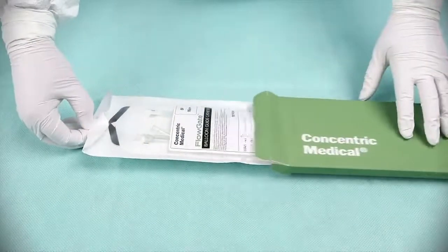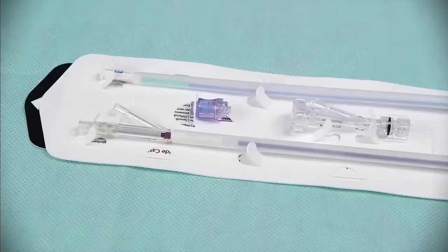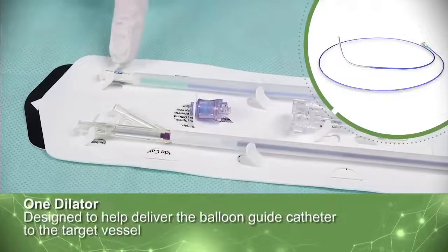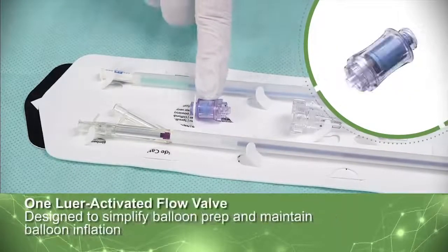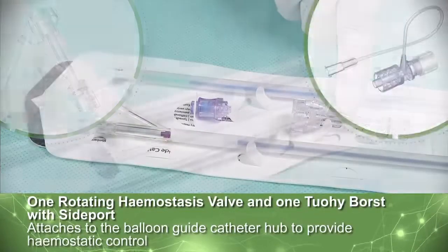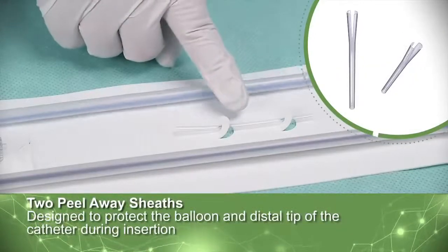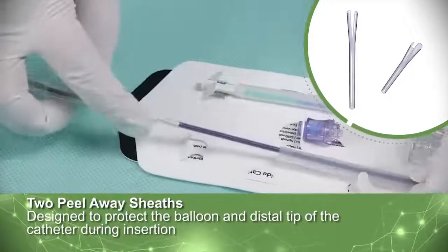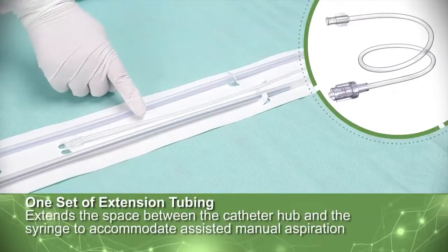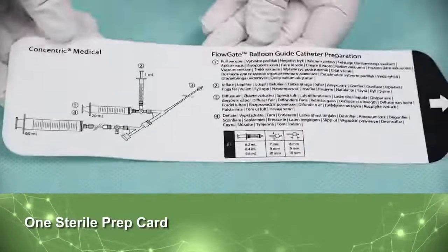The Balloon Guide catheter is packaged with a number of accessories. Each sterile package comes with one Balloon Guide catheter, one dilator, one Luer-activated flow valve, one rotating hemostasis valve, one Tuohy-Borst with side port, two peel-away sheaths, one set of extension tubing, and a sterile prep card to reference when prepping and using the Balloon Guide catheter.